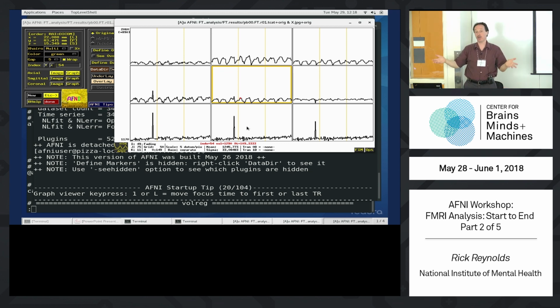So you have to interpolate. Now you're blurring things together. If you have a motion spike here, no motion here, no motion here, and you average them together, now you have a different spike. Maybe smaller, maybe bigger, who knows? So motion is a problem.